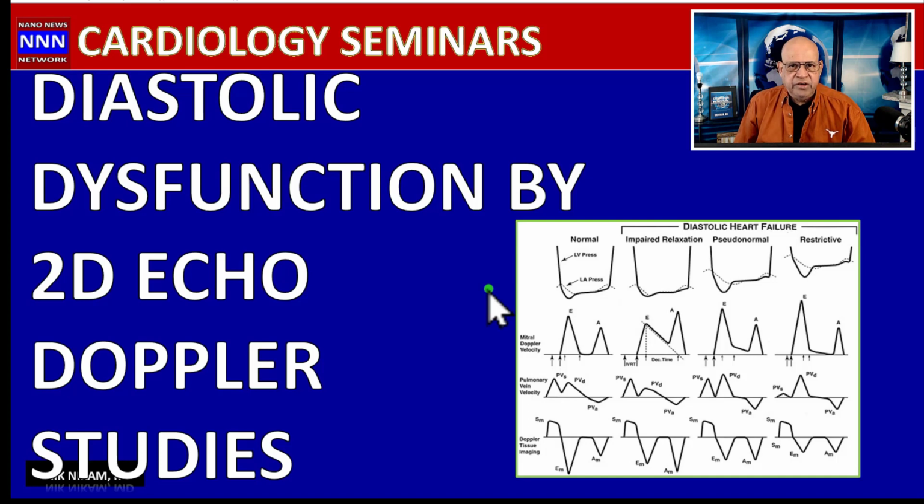The feature presentation is Diastolic Dysfunction by 2D Echo Doppler studies. Diastolic dysfunction is one of the most disheartening conditions we deal with as cardiologists, and we need to understand how much of this diastolic dysfunction is reversible and how do we detect early diastolic dysfunction and try to prevent it from going to the worst possible scenario.